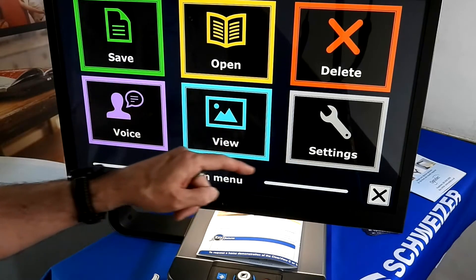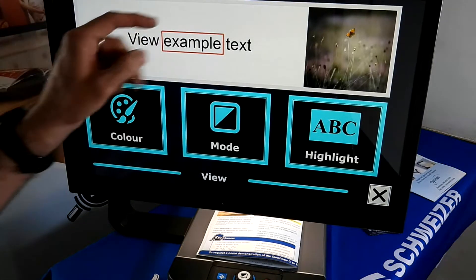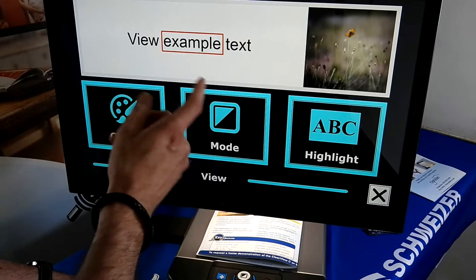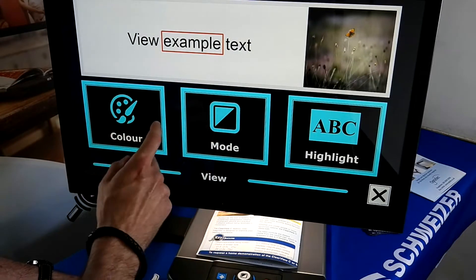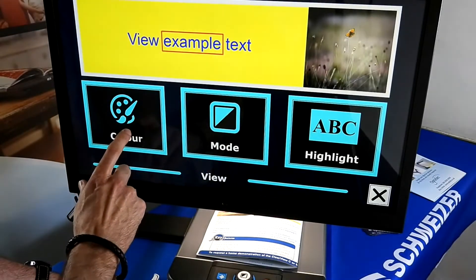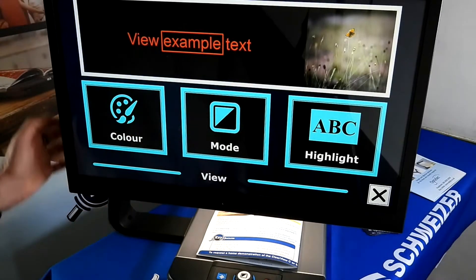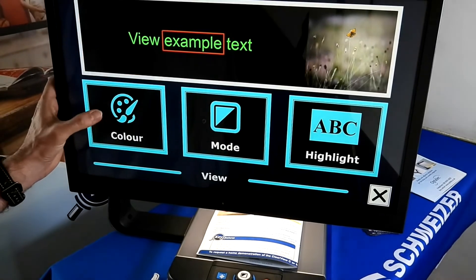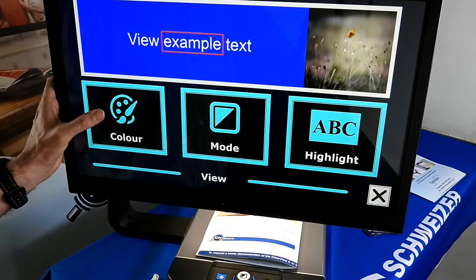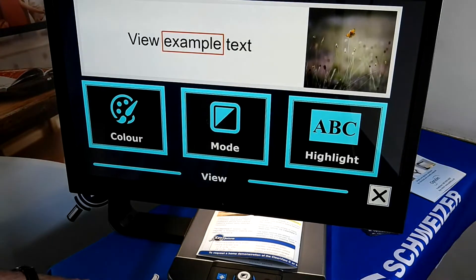We can also access View and Settings. The View menu allows you to view the text with the photograph in place, but if you want the text in different color combinations — black on yellow, yellow on black, blue on yellow, yellow on blue, red on black, black on red, green, black on purple, black on blue, white on blue, or black on white — all those options are available.